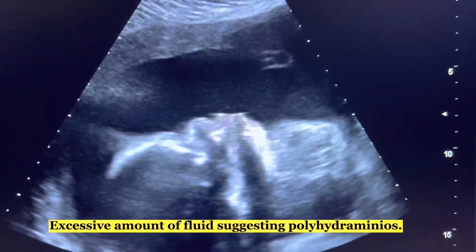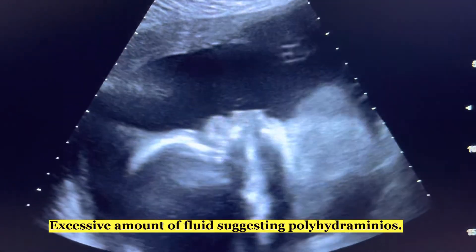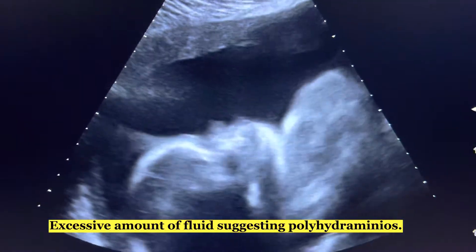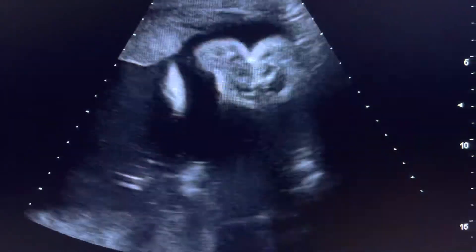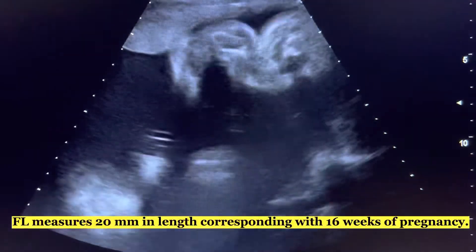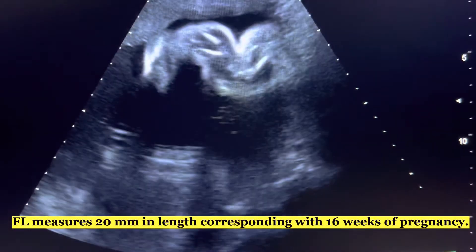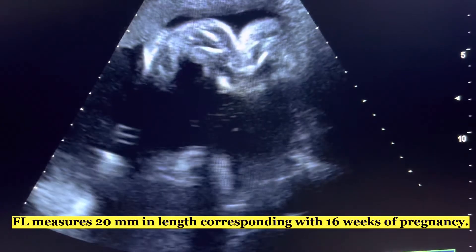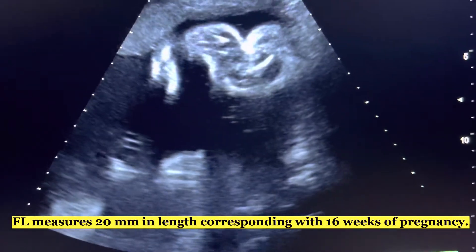There is an excessive amount of fluid, suggesting polyhydramnios. FL measures 20 mm in length, corresponding with 16 weeks of pregnancy.